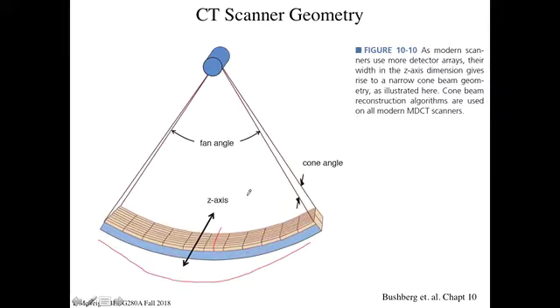Up to that point, to do multiple slices, we'll see, you had to sort of stop and take a whole bunch of slices, and an exam would take 20, 30, 40 minutes, right, for a patient. Now an exam takes 4 minutes. Like you get them in, you go boop, and then off, next patient comes in, right? And so it becomes exceedingly cost effective, because you can just do many, many patients in a short amount of time.